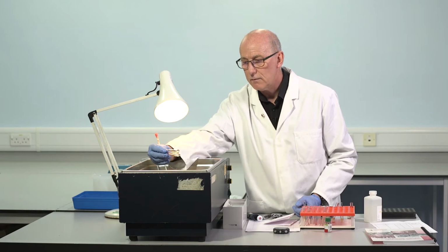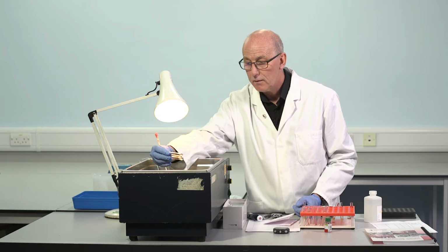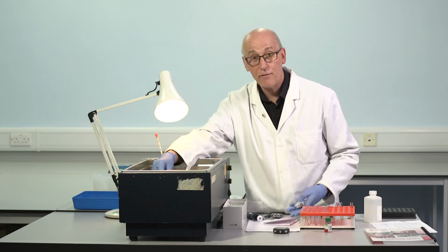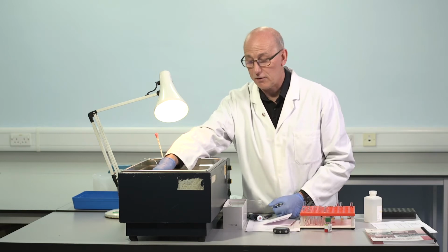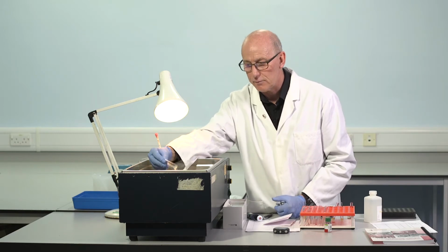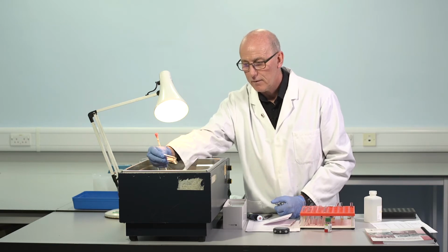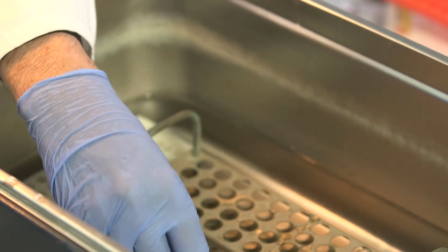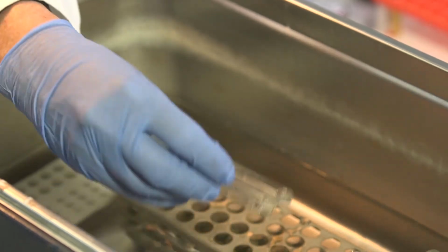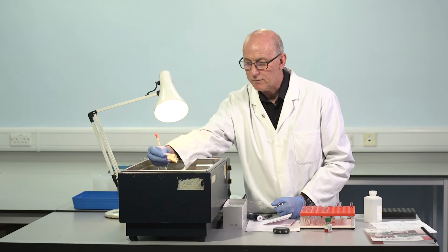There is a recommended frequency of this tilting process. It should be 3 times every 5 seconds through 90 degrees. So 90 degrees to the horizontal and back. And that's more or less the frequency with which I'm now doing. 3 times every 5 seconds, 90 degrees. With the regular immersion, we're helping to maintain the temperature. Just waiting for the third one to clot.